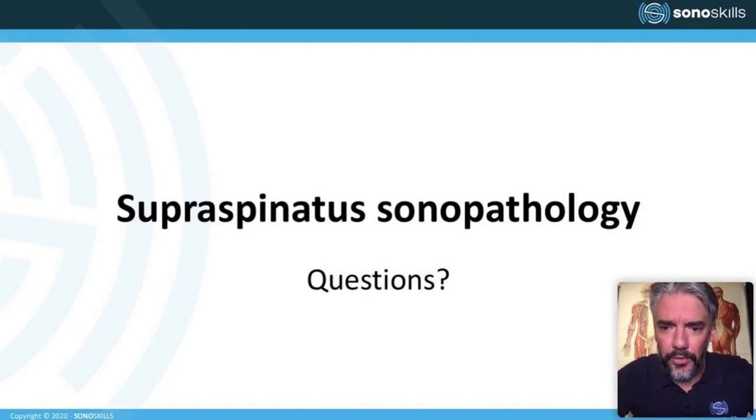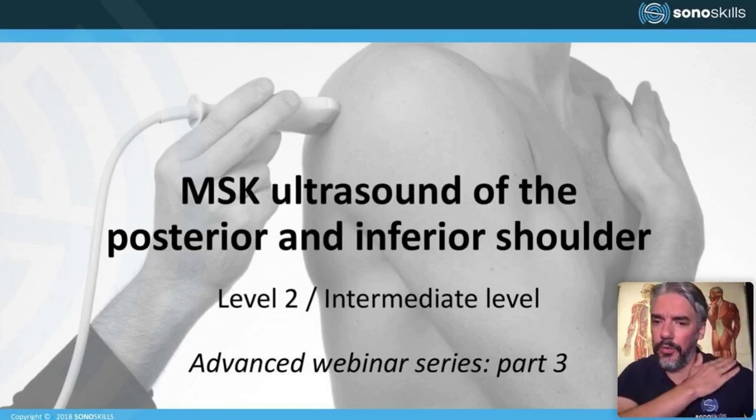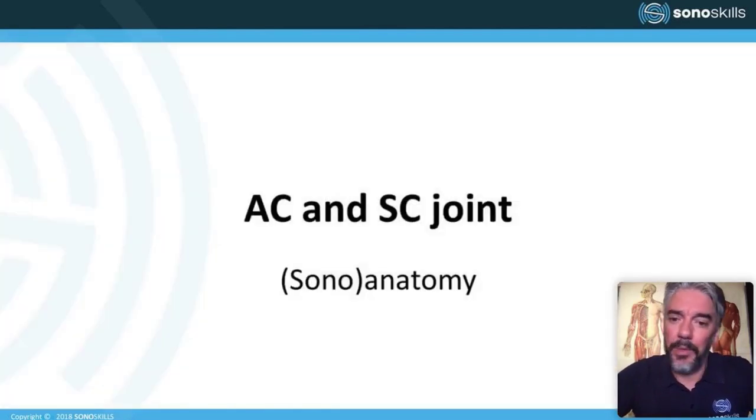Okay, so let's go back to the last presentation of today, the part 3 presentation. Now we are going to discuss the posterior and inferior shoulder, and actually also the superior shoulder, because first we will start with the AC and SC joint. By the way, I'm really enthusiastic. Once again, my favorite topic, shoulder and MSK ultrasound.